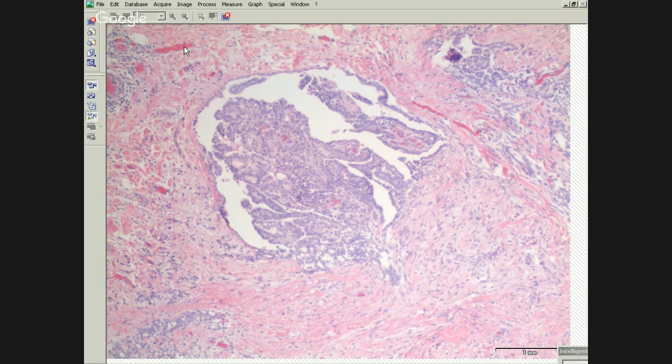And then on your carcinoma side, you want to get some general markers, like you said, Ber-EP4, CEA, those are good. B72.3 is also another one. LeuM1 or CD15 is good. That one tends to stain a lot of background inflammatory cells, so it can be a little messy. And then TTF1 can be useful since most of the time you're going to be considering lung adenocarcinoma.